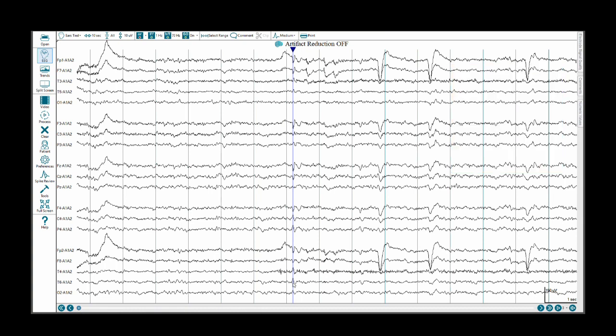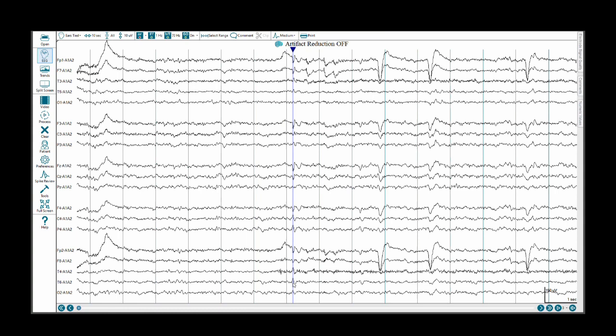It's just that the way the gray matter is oriented, including the cell bodies, the axons, and the dendrites, the way they are oriented with respect to the horizontal plane is that the surface electrodes are going to record the negative component. In most cases, there are exceptions. One exception is the normal variant 14 and 6 positive spikes. Another variant would be lambda waves, as well as posts. Also in neonatal EEGs, their epileptiform discharges and seizures can have a chief or main positive component.